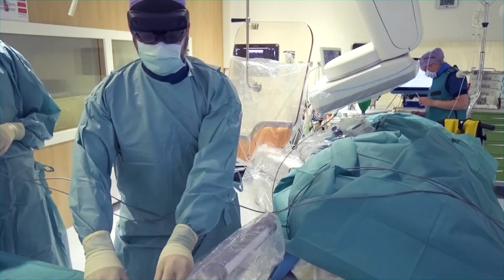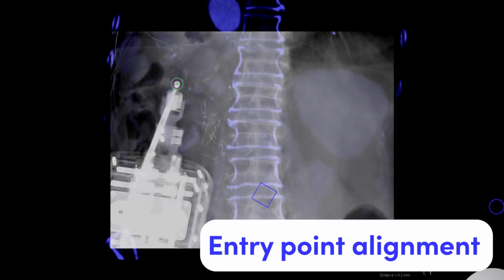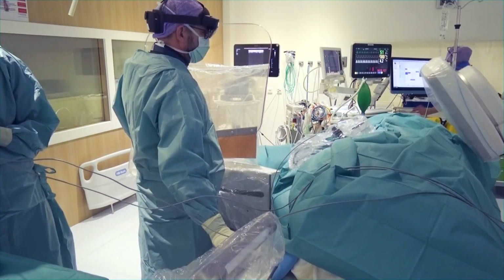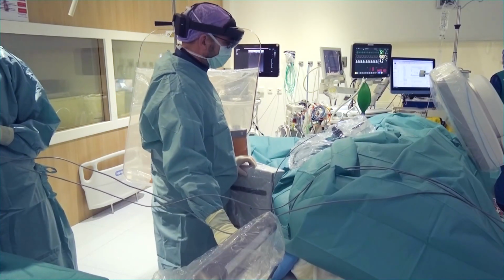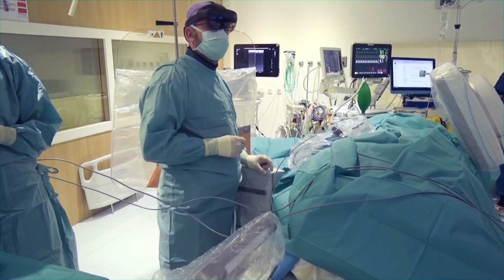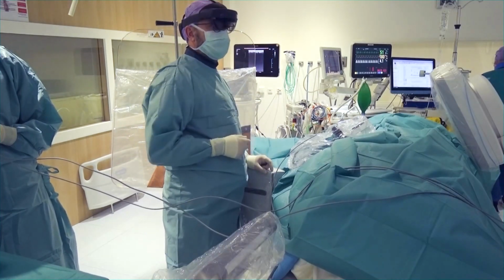Positioning of the robot is very easily performed by just selecting translation and angulation and aligning the needle with the designated needle path. The progression of the needle is monitored by a 90 degrees perpendicular progression view that shows us the progression of the needle along the needle path in fluoroscopy.